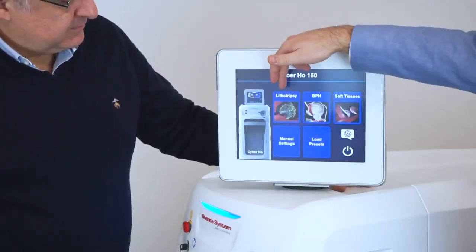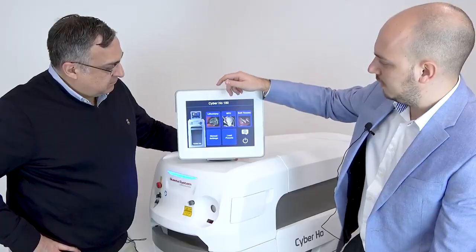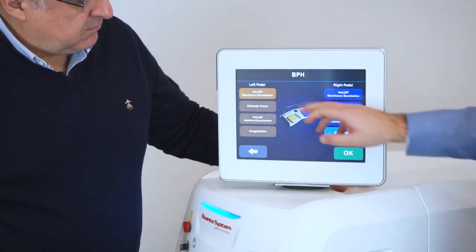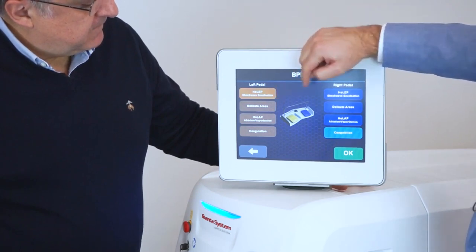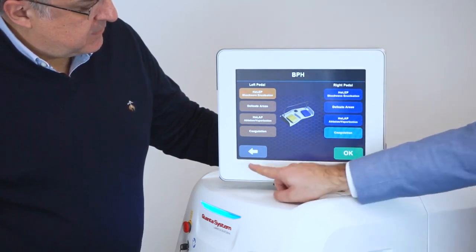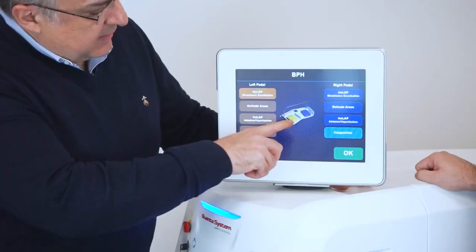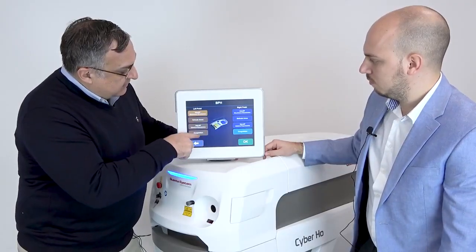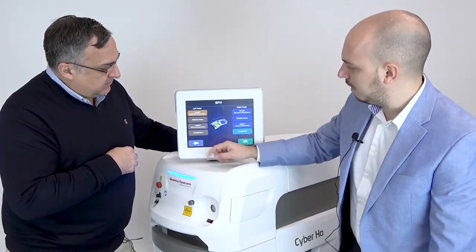You can pick from lithotripsy, BPH, and soft tissue — pretty easy. Since you're a top expert in enucleation, let's start there. You have a dedicated setting for enucleation, one for delicate areas, one for ablation or vaporization, and coagulation settings. The pedal has two switches plus a third one on top, and you can preset what happens when you press each pedal.